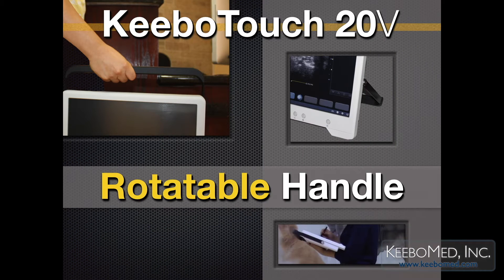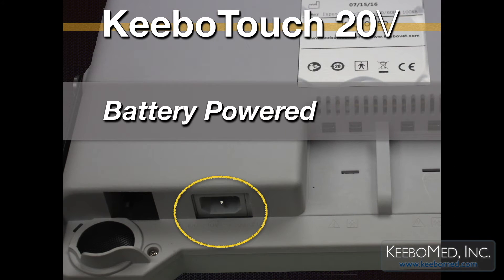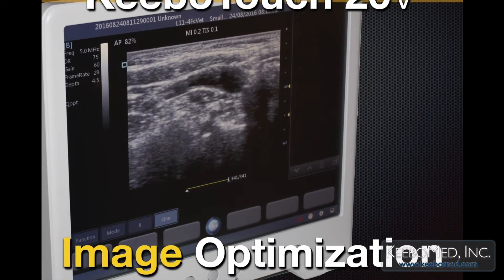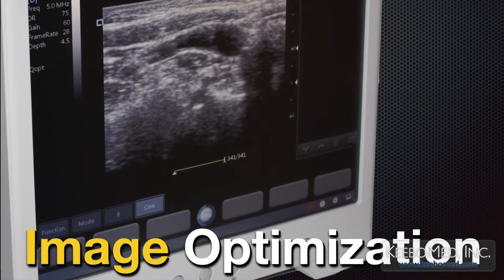The handle is strong and can be rotated. Kibo Touch 20V is a battery-powered ultrasound that uses a lithium rechargeable battery. You can work with the power cord connected to the machine, or disconnect the cord once the battery is charged.